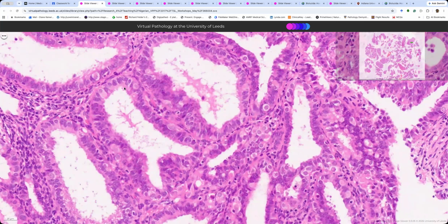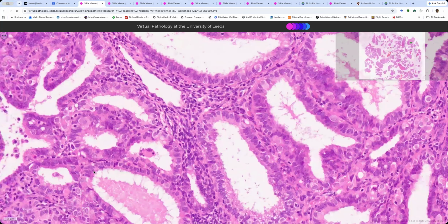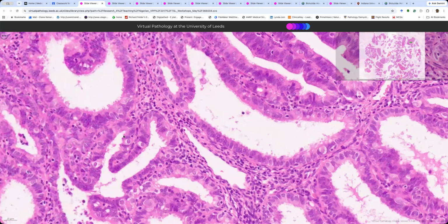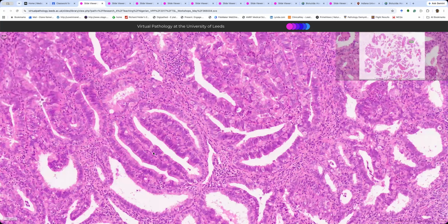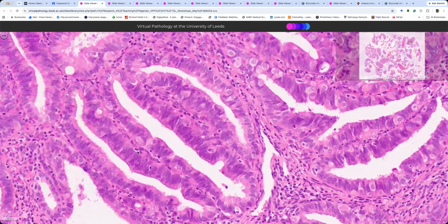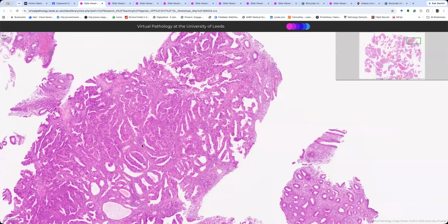The glands are more rounded than normal endometrial glands, and they've got nucleoli, which is what atypia is. They start to look squarish. They start to get nucleoli here, right? They're becoming really crowded. I mean, the cytology of this is like endometrioid carcinoma. What am I going to call this?